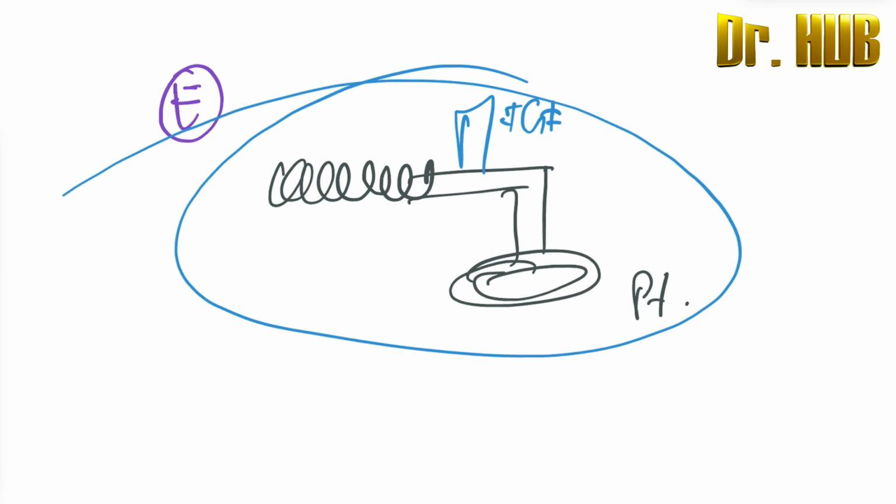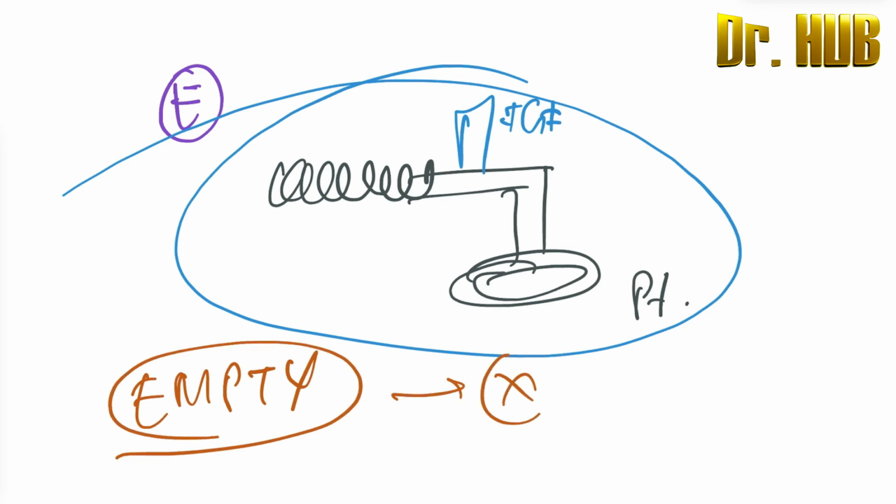So E means it is empty. E for empty. This is very easy to remember. Empty means there is no reservoir bag. RB is absent. Now this was about the Mapleson E. Now we look at the Mapleson F.